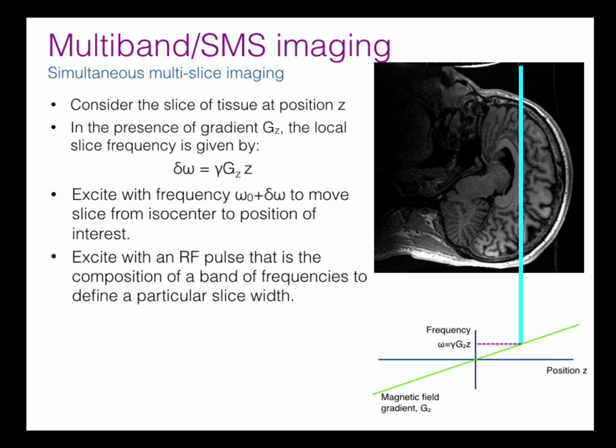So moving on from parallel imaging, or perhaps this could be considered yet another case of parallel imaging, is a technique known as multiband or simultaneous multi-slice imaging. In this case, rather than trying to do something during the image encoding process, we excite multiple slices simultaneously. Before, when we wanted to excite a single slice, we used a group of frequencies centered at a center frequency. And that band would excite a narrow slice within our object or our subject.